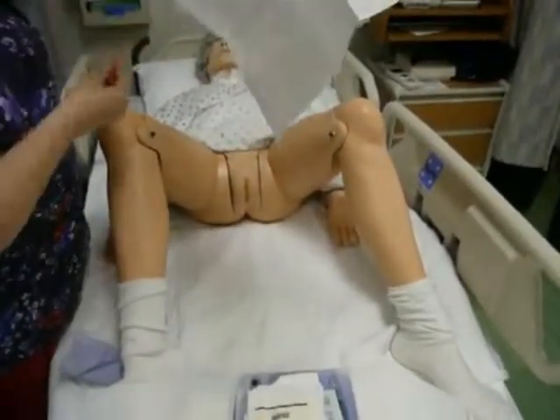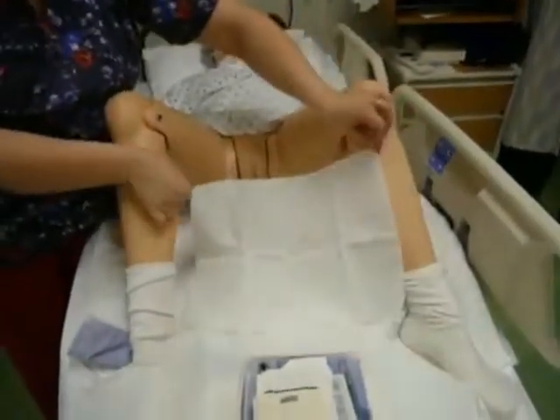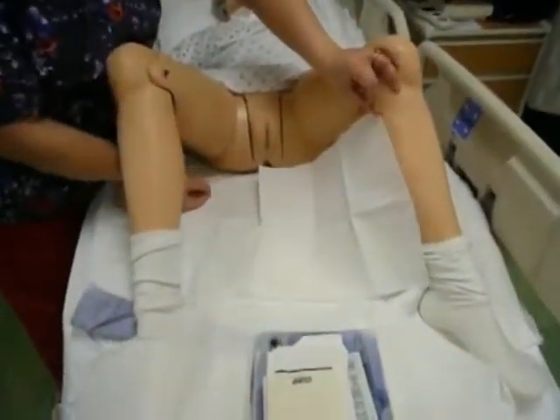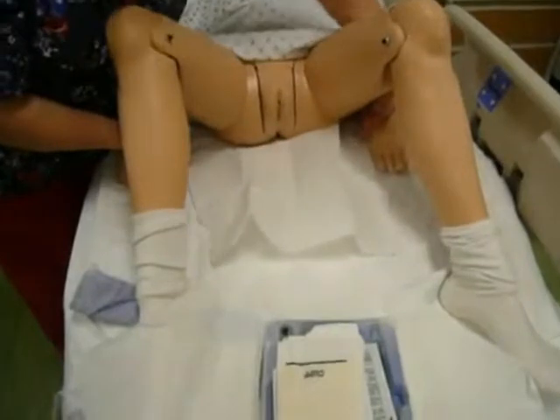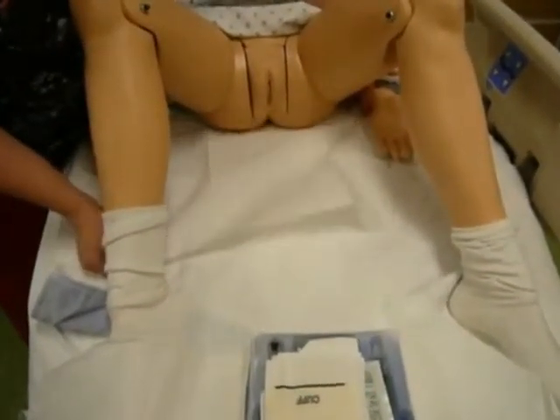So that it falls and I can find the edges, and I want to open it up with my hands. I can walk around if I need to, and what I'm going to end up doing is setting it down like we do with other sterile fields with minimal crossover. Now if the patient is able to, you're going to have them lift up their hinders so you can slide it underneath.